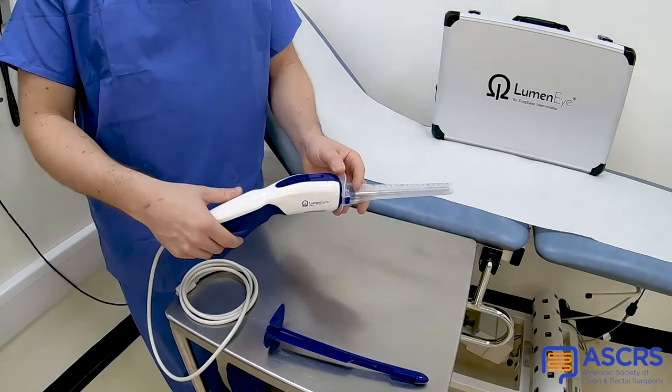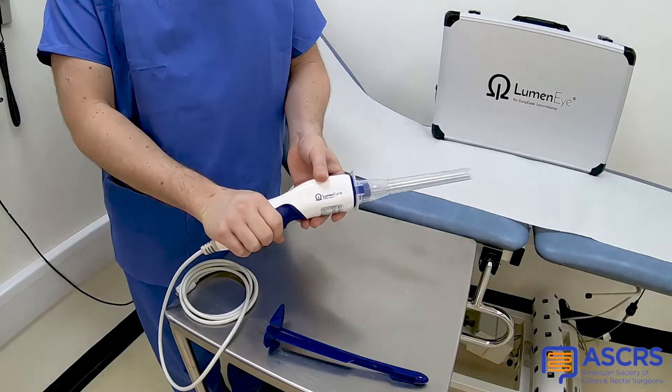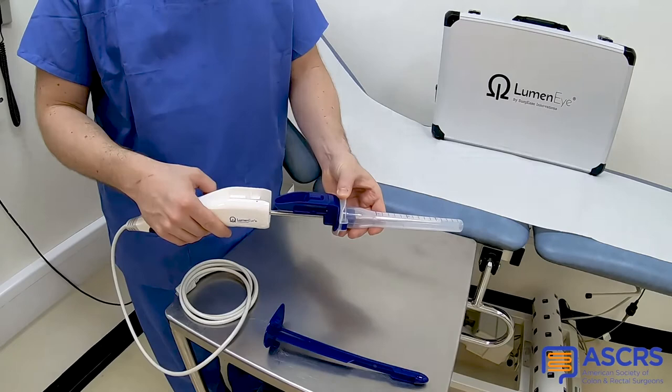Insufflation is achieved by compressing the bellows within the handset. This is easily done with one hand. Air can be released by ejecting the handpiece from the manifold, which is then easily reconnected.